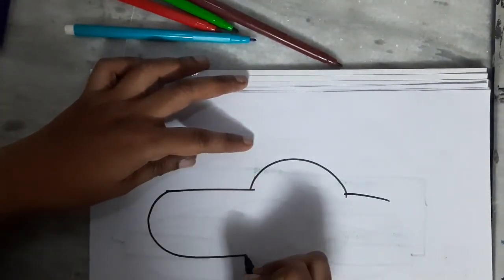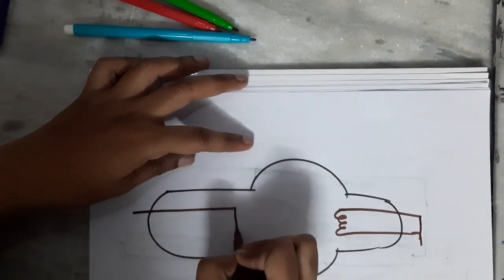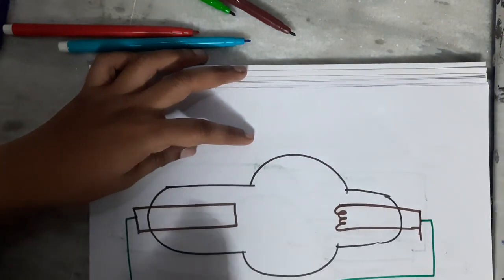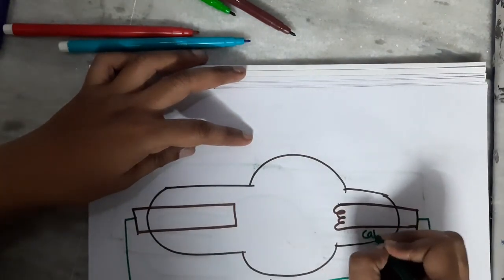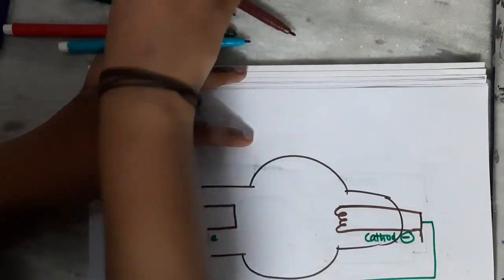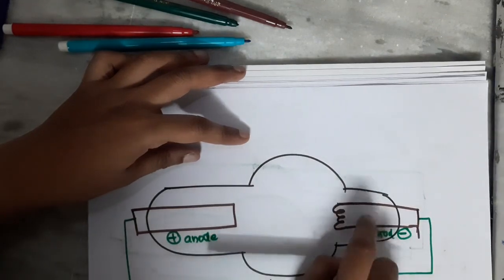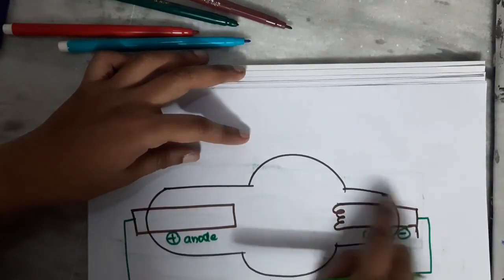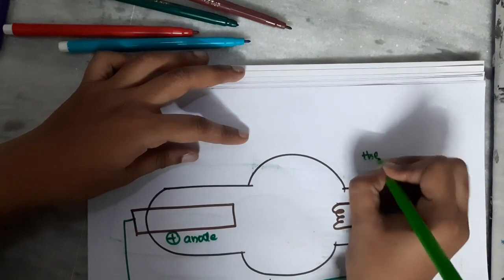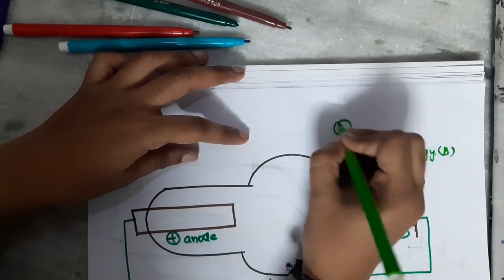I am drawing the same diagram again and again in order to understand properly. So when a potential difference or current is applied, this is the cathode, which is negative, and the anode, which is positive. Whenever you pass current to the X-ray tube, the cathode will get heated. When the cathode gets heated, it releases a certain amount of thermal energy. What is this thermal energy? It is nothing but heat.